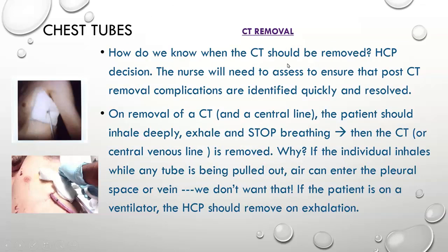When should the chest tube be removed? Well, really, that's a healthcare provider decision. The nurse is going to assess, and you can report what your assessment findings are, but it's up to the physician. And once the chest tube is removed, you want to make sure that you assess the patient, because if the patient's not tolerating their chest tube removal, then they can go down in a hurry, and you need to identify that.